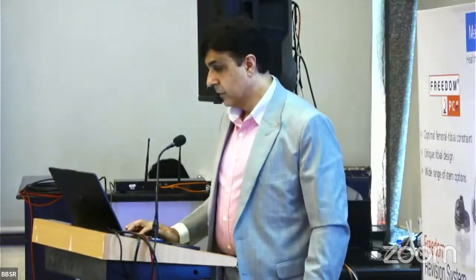Also at the same time, with the inventory of revisions available in our country, the moment you get people with small sizes and you get females with bowing of the femur, be very clear, you're going to have tougher times. Ask for shorter stems, ask for cemented stems as backup options. Otherwise, you're going to be perforating those cortices, or you're going to have a troublesome time balancing your flexion gap to be equal to your extension gap, because the stem is going to be dictated by the way the femur is aligned. So these things are important, and also a lot of companies are now working in the background on coming up with small size offset couplers. That's a second option.